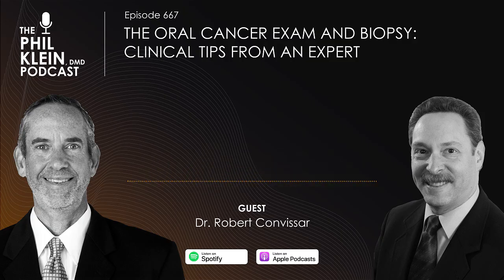Now, when you're talking about getting it all, you're talking about the perimeters of the biopsy being clean? Yes, I'm talking about clean margins. And in order to get those clean margins, is there any particular biopsy technique that you recommend? It depends on the size of the lesion. It depends on the shape of the lesion. If they're benign, lesions are relatively discrete. You know there's a beginning and an end. You know there's a definitive margin. Something that's malignant, you can't tell where it begins and ends. It just blends into the surrounding tissue.